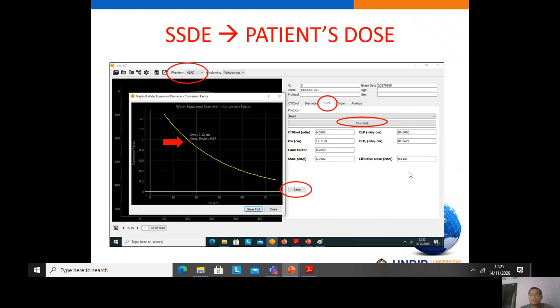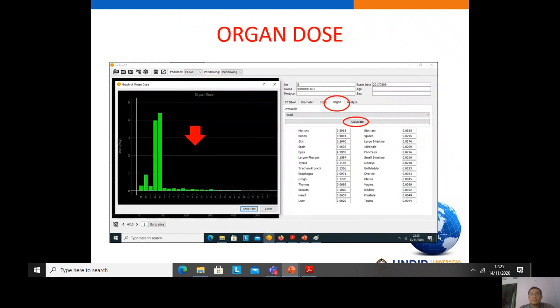Effective dose is the metric for estimating the cancer risk of the patient. If you want to know the organ dose from this examination, we select the protocol, calculate, and get the estimation of the organ dose along with a curve of the organ dose.